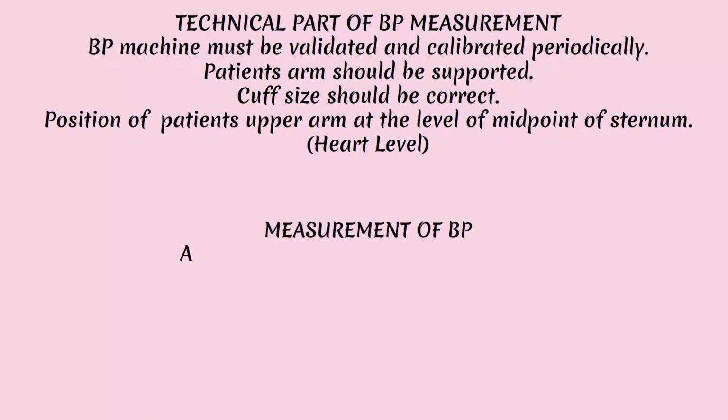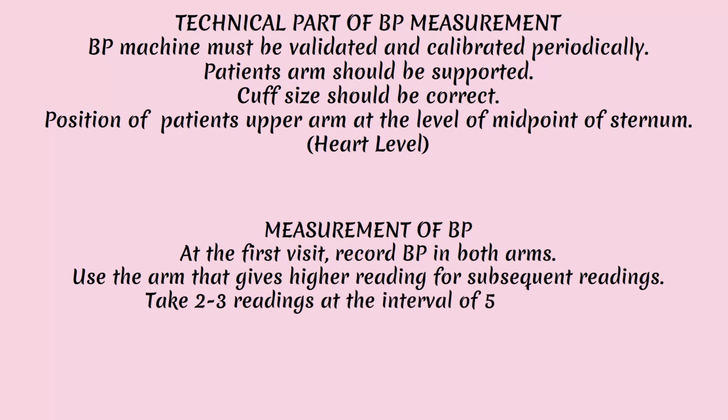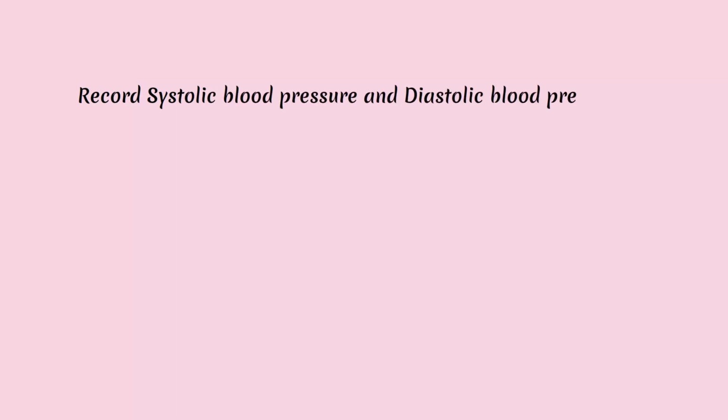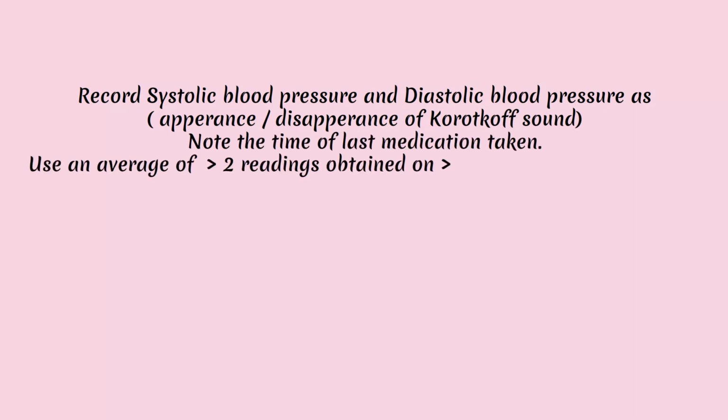Measurement of BP. At the first visit, record BP in both arms. Use the arm that gives higher reading for subsequent BP measurement. Take 2 to 3 readings at the interval of 5 minutes each. Inflate the cuff 30 mmHg above obliteration of arterial pulse. Deflate the cuff at 2 mmHg per second. Record systolic and diastolic blood pressure as appearance and disappearance of Korotkoff sounds. Note the time of last medication taken. Use an average of more than 2 readings obtained on more than 2 occasions to estimate the level of BP.